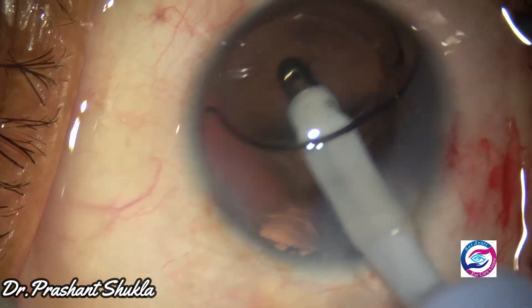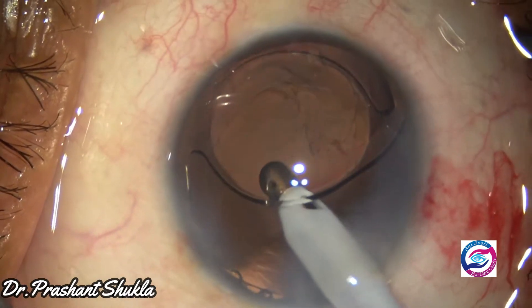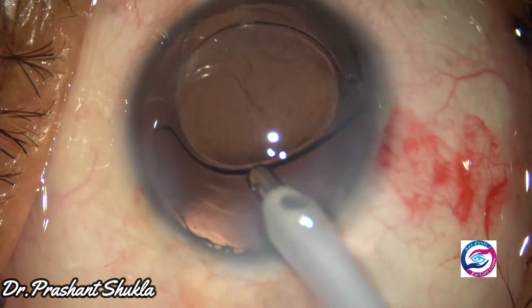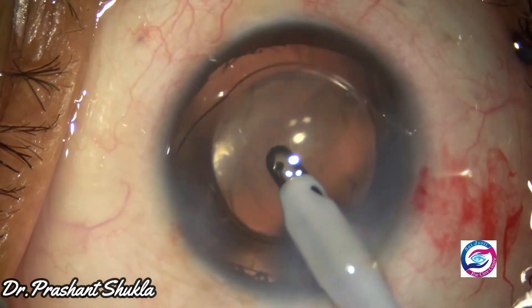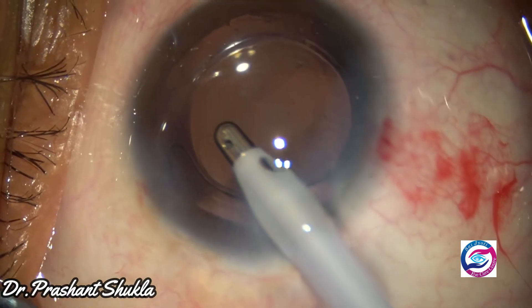Now is the time to remove the viscoelastic substance both from behind the intraocular lens and in front of the intraocular lens. It is very important to thoroughly remove all the viscoelastic from the eye before closing, so as to avoid any post-operative rise of intraocular pressure.